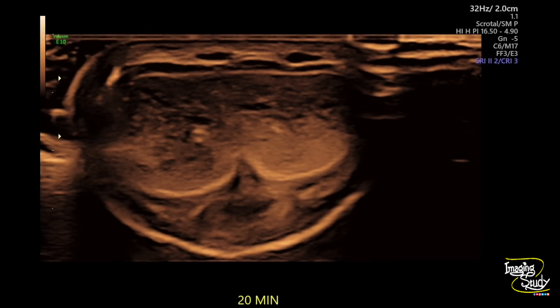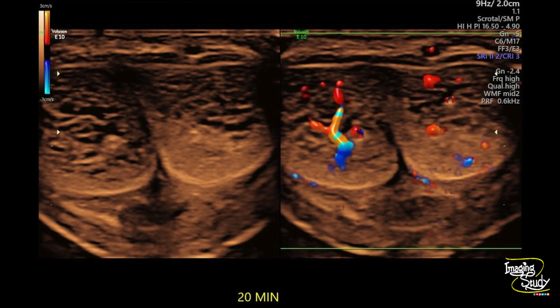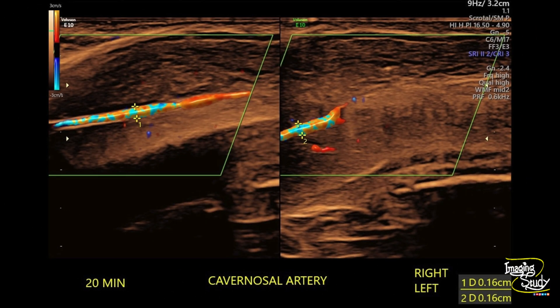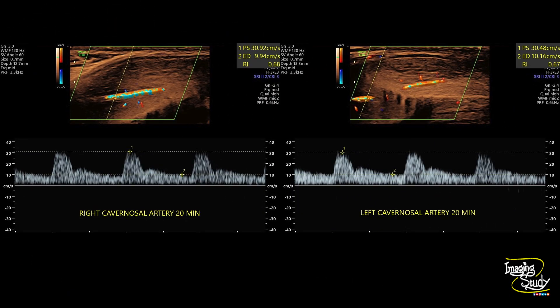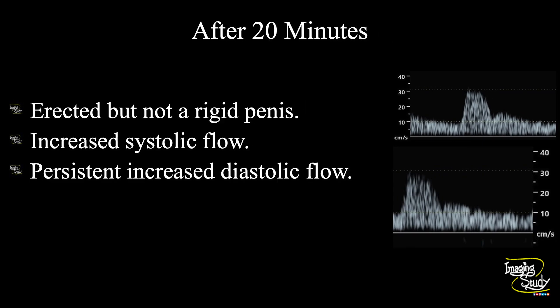Now at 20 minutes the venous sinusoids are showing blood-filled spaces and prominent arteries are visible. The diameter is similar to previous scans. The peak systolic velocity is slightly reduced compared to the 15-minute scan but still elevated. The diastolic flow is almost unchanged — it is not decreasing. The end-diastolic flow velocities are still around 10 cm/s; they should have reduced below 5 cm/s by now. The penis is still erected but not rigid. This persistent elevated diastolic flow over this long period indicates venous leakage and confirms a venogenic cause of erectile dysfunction.